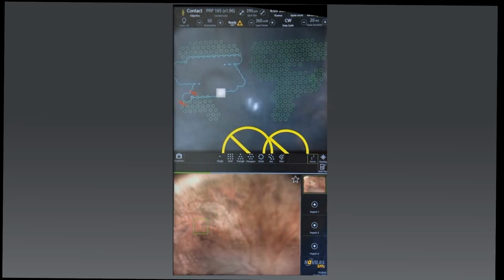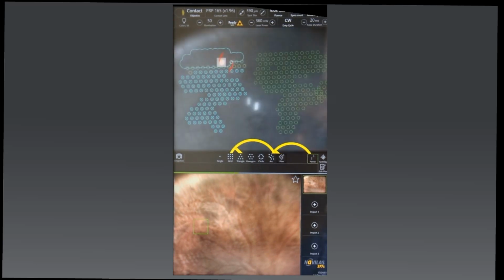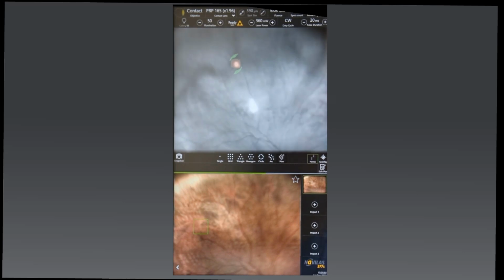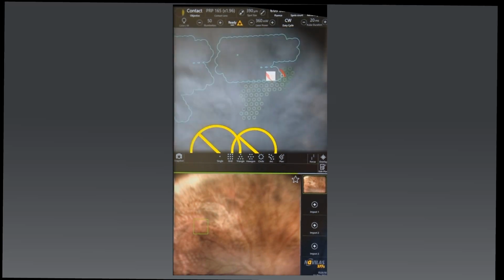Certainly the eye movement there seems to be pretty minimal. Yeah. The patient's not reacting backwards. Yeah, and I think his comment at the end of it said it all really. That was just so much better than the last time, and yet we've probably done a huge deal more laser than he's had the last time. So the treatment speaks for itself really.